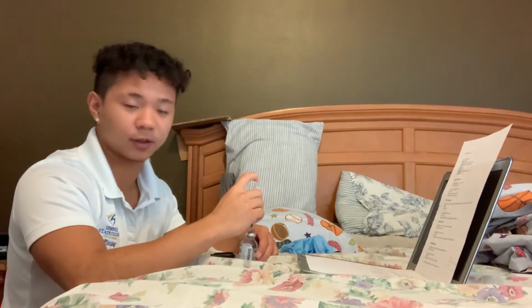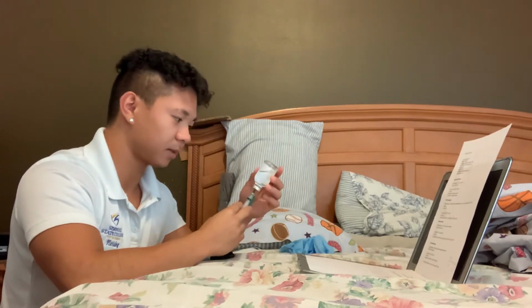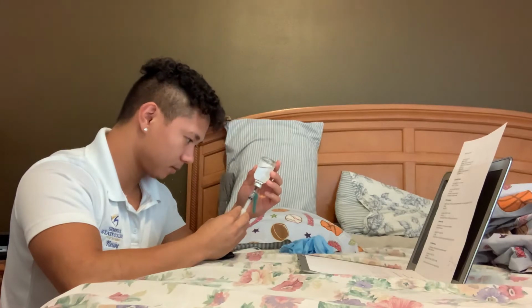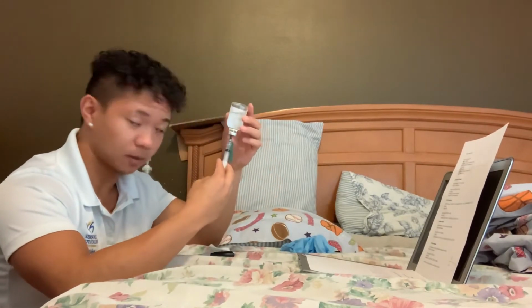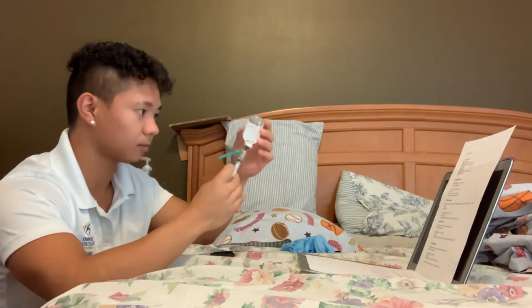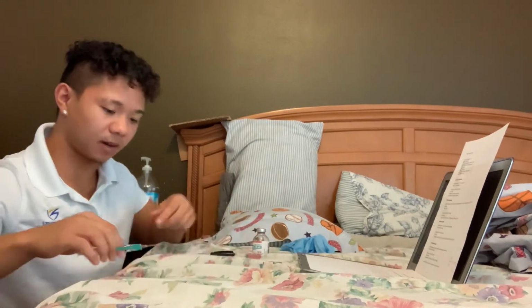And now I'm just going to invert the vial, and I'm going to draw up 0.5 milliliters of the medication. I'm doing this at eye level. And I'm just going to safely recap.